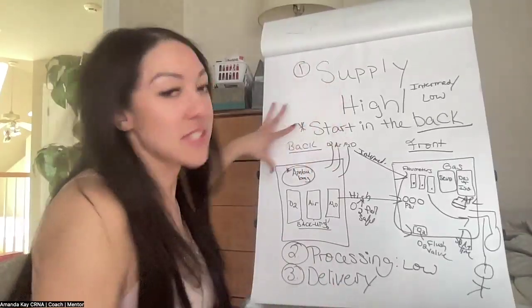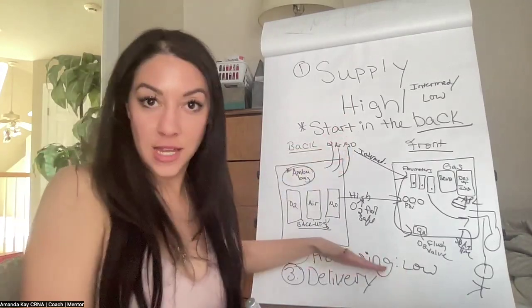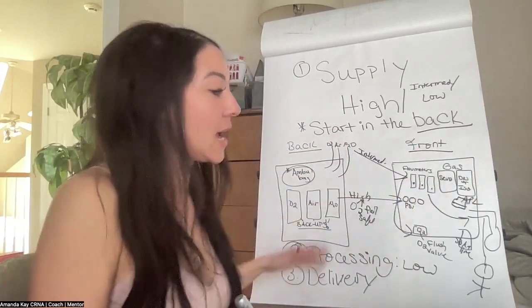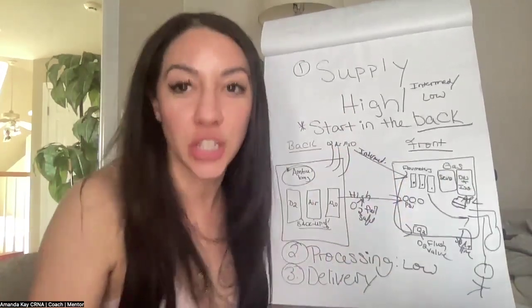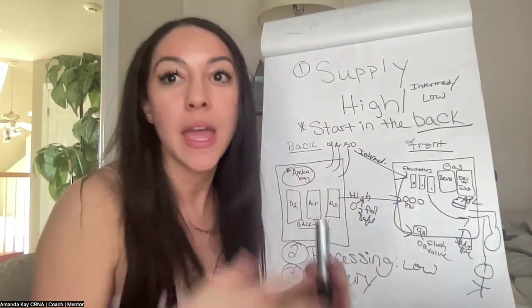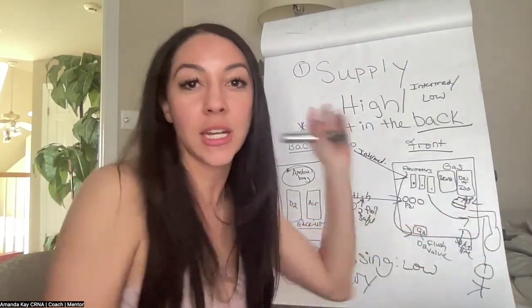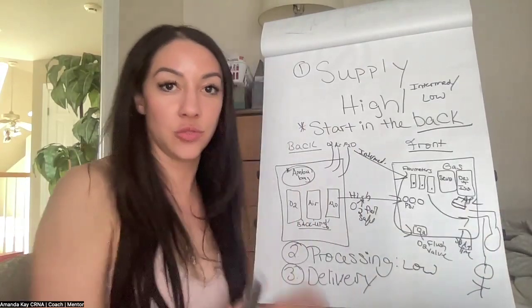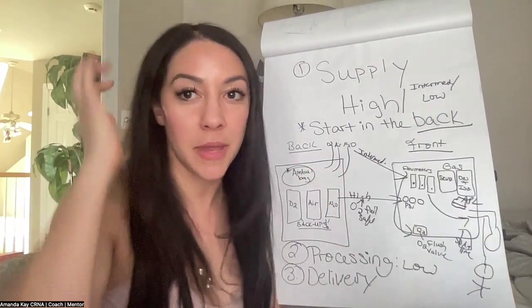All right, so we have supplied our machine with the goods. We have processed them. We have done all the processing. Now, step 3, deliver. Now we need to deliver all the goods to our patient. This is essentially your breathing circuits that you connect to your machine and that connect to your patient, whether you're masking them, you've tubed them, or you LMA'd them, whatever it may be.